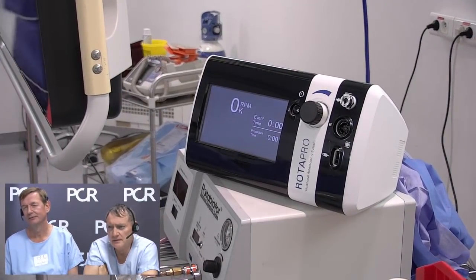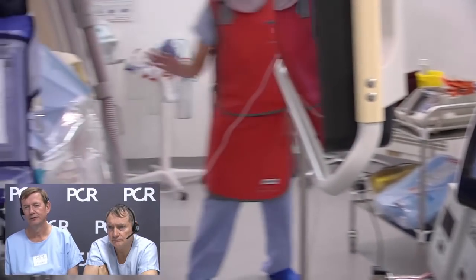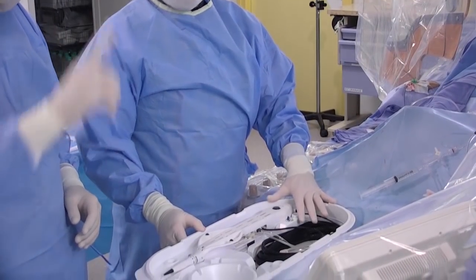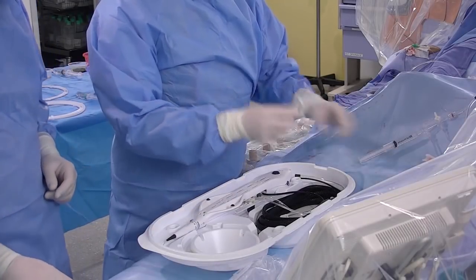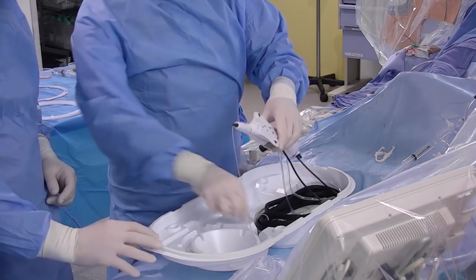Can you see the box? So this is what we will use. This is a clip.